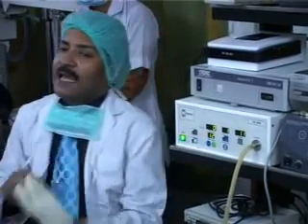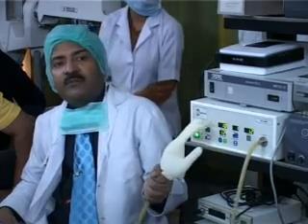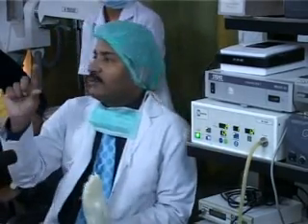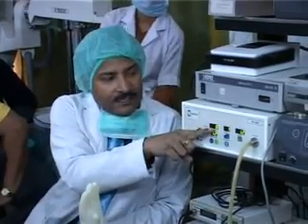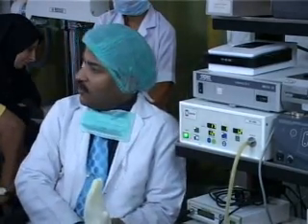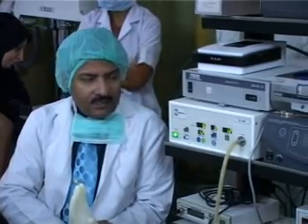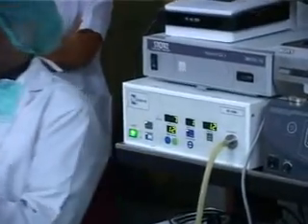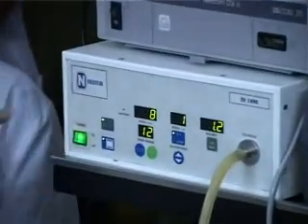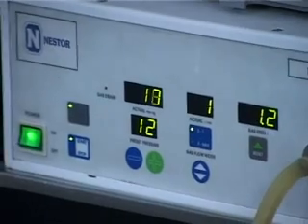So how will you know the actual pressure with the Veress needle? Actual pressure with the Veress needle will be known by the minimum out of 5 readings. Now you will see that minimum 0 will not come. How much is the minimum? Minimum is 4. Now the minimum is 6. That means actual pressure is 6. And as soon as this 12 will come, flow will itself stop. You got it? But there is some error, sometimes 17, sometimes 11.